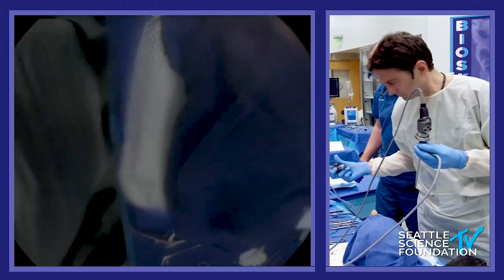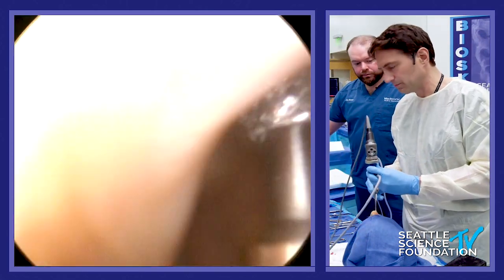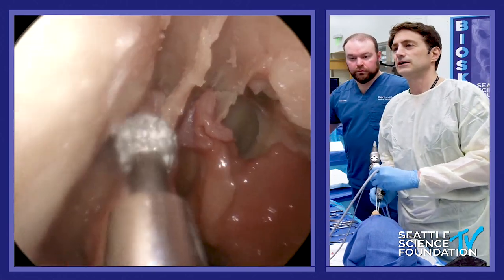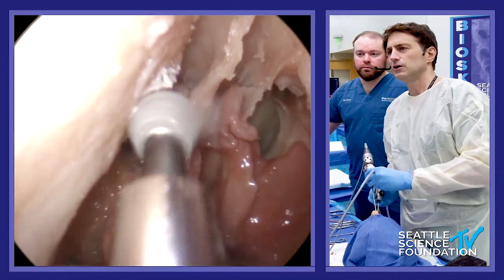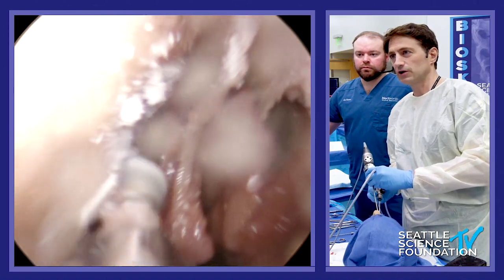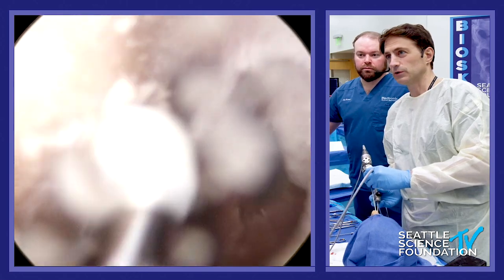At 30,000 RPM — may need the suction because this is going to clog in two seconds, but we could just let it fill up. You can start drilling this area, which Richard Harvey likes to call 'Carolyn's Window' after one of his fellows.